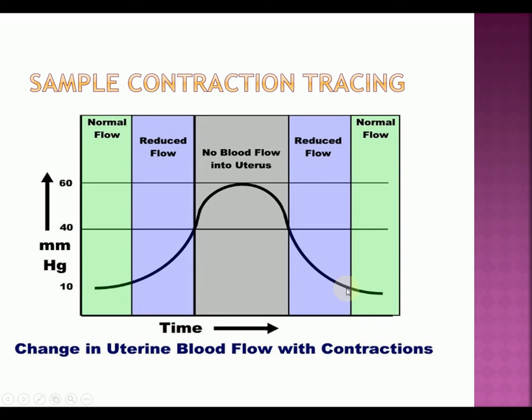Duration simply means how long the contraction lasts. Does it last 20 seconds? Does it last 30 seconds? Is it lasting at least 60 seconds? We really like to see them lasting at least 60 seconds, but we don't like them to be more than 90 seconds, because then there is too much time where you don't have blood flow.